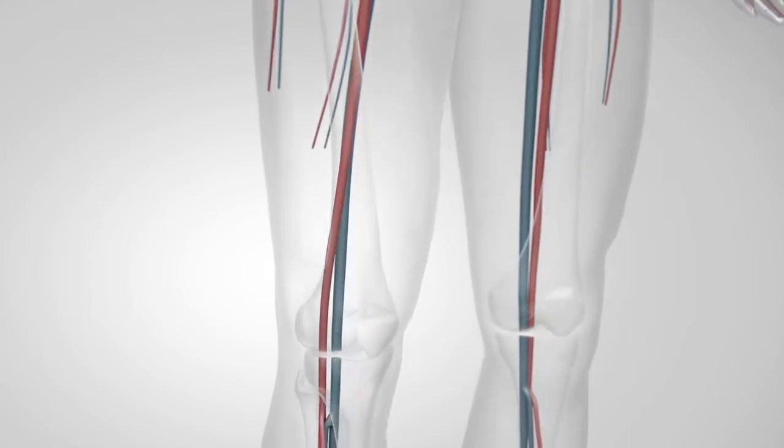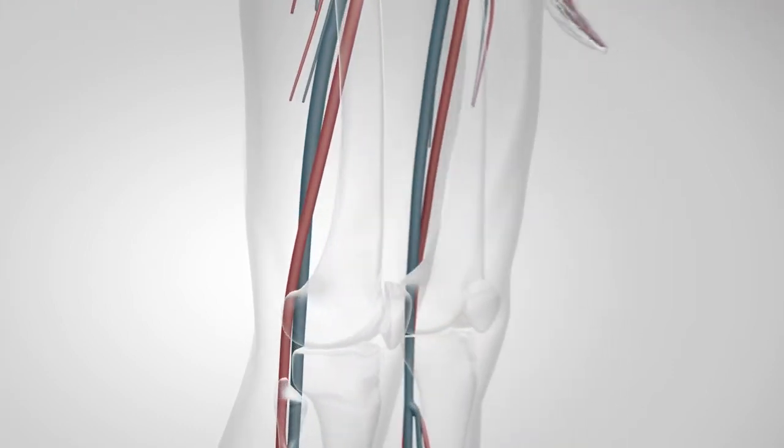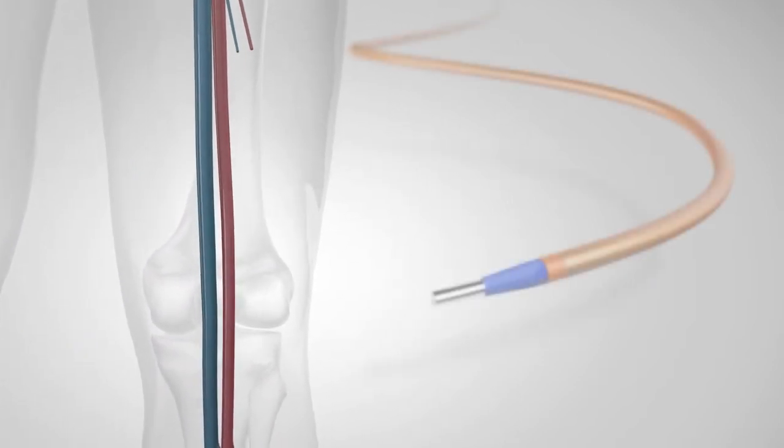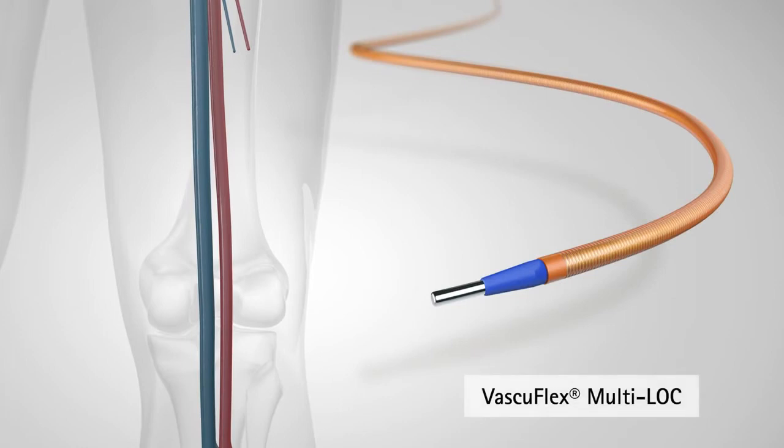Stenting in particular in the proximity of the knee is most challenging due to biomechanical forces acting on the stent. The multiple stent delivery system VascoFlex Multi-Lock is made to handle these challenges. With six short stents mounted on one delivery system, VascoFlex Multi-Lock enables spot stenting only where it is really needed.